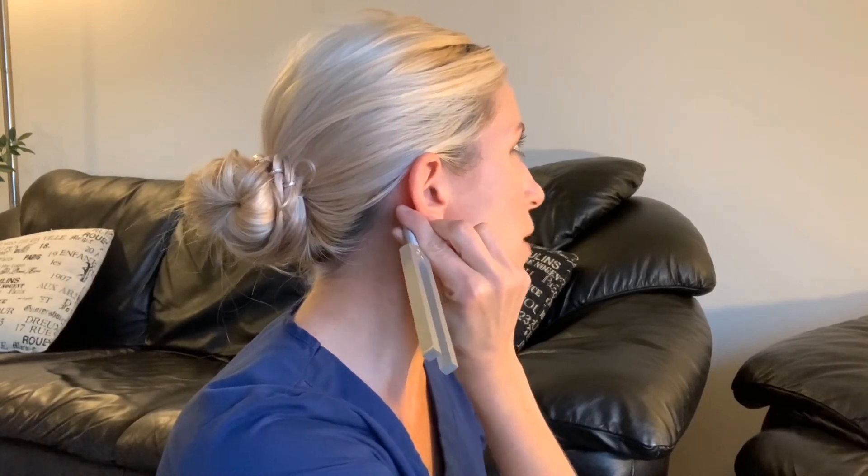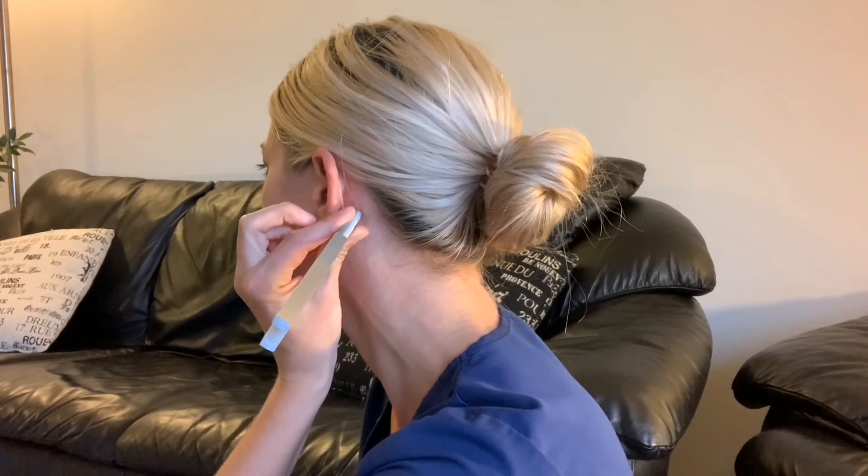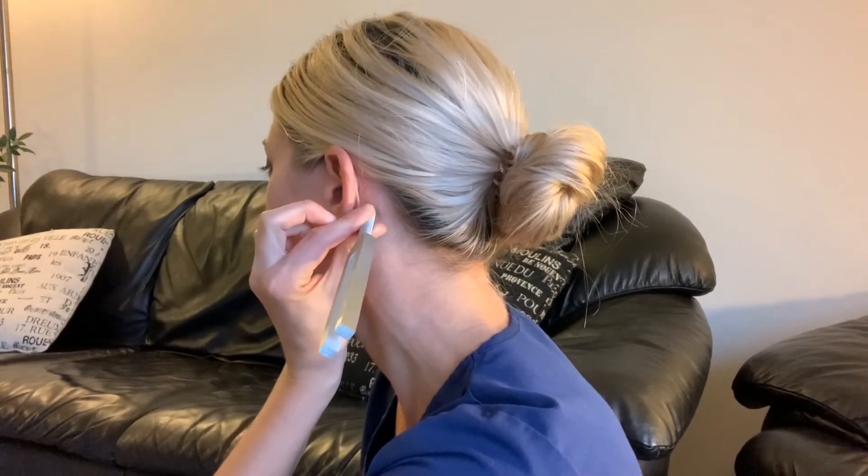I can no longer hear the tone, so I'm going to bring it to the outer ear. And now I can no longer hear the sound — that would be a normal Rinne test in my right ear. Now we're going to do the left ear. I'm going to activate it on my knee. We're going to hold it on the mastoid bone. I can no longer hear it, so I'm going to move it to the outer ear. The left ear is also normal, or a positive Rinne test, which means that air conduction is approximately two times that of bone conduction.